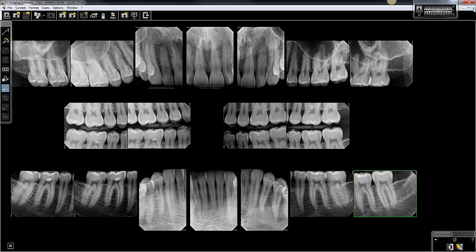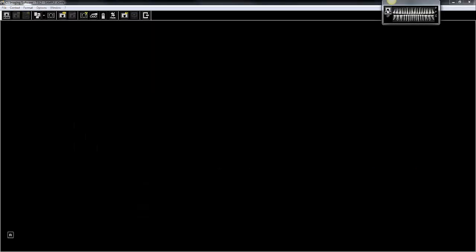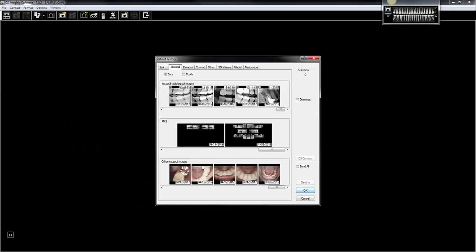Now we can close out of this and come to our image history. There's the format we just acquired, and when you hover over it, you'll notice that the note I entered pops up, and in the bottom right corner is the date I manually entered. So that's how you can mount JPEG radiographs from another office. Hope you found that helpful.